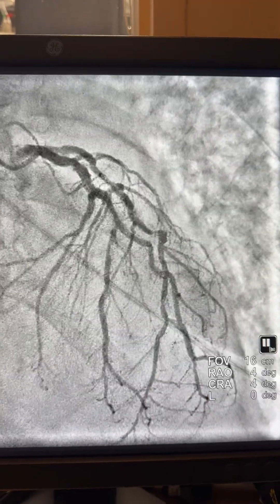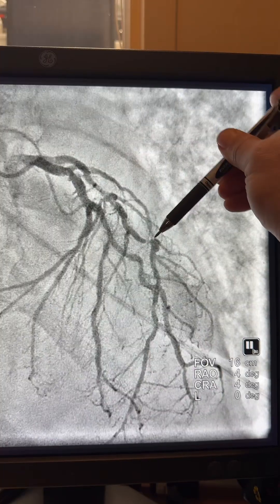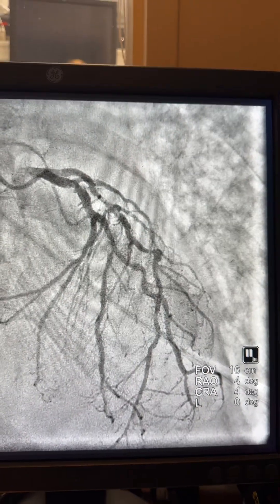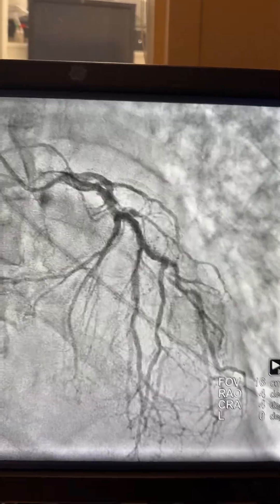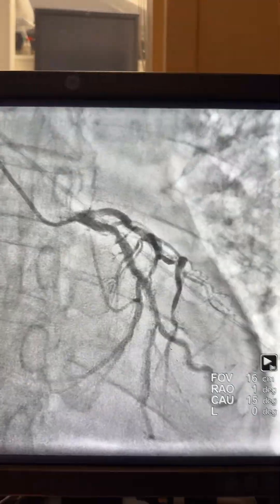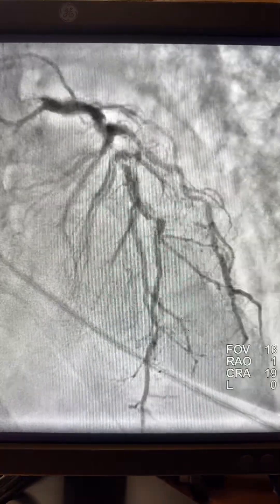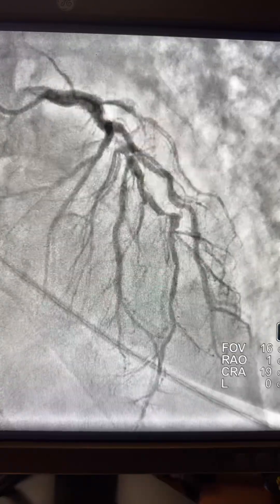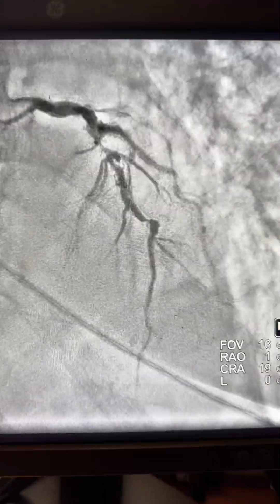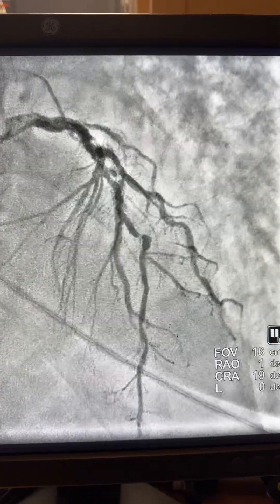You can see here we have heavily calcified vessels. We have this tight lesion in the LAD, which is the most proximal to mid-distal segment. Here are different views of the lesion we need to work on right now.